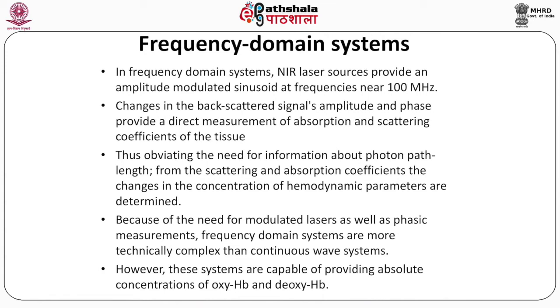So the photon path length is determined from the scattering and absorption coefficients, and from this, the change in concentration of the hemodynamic parameters is calculated.